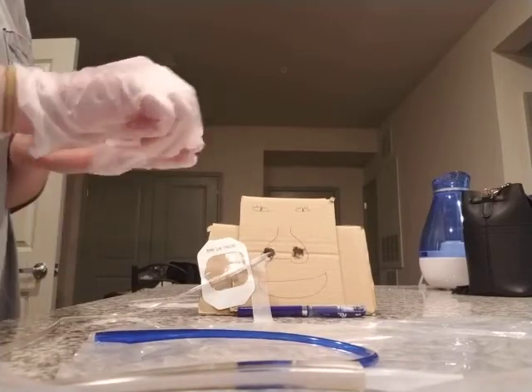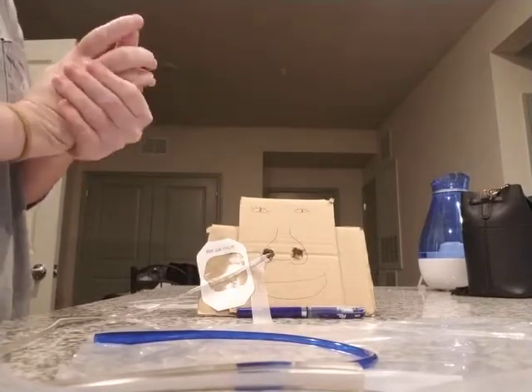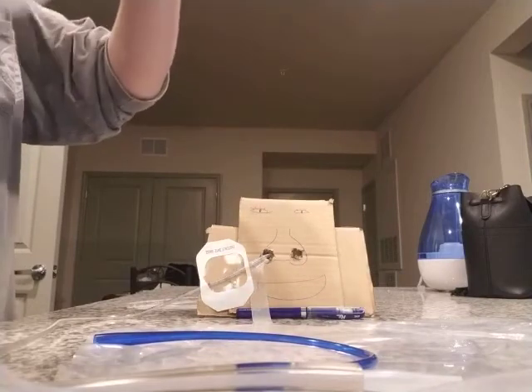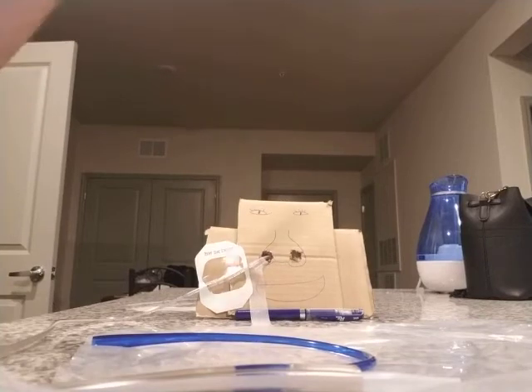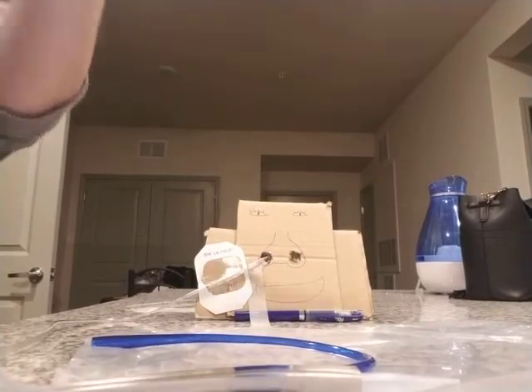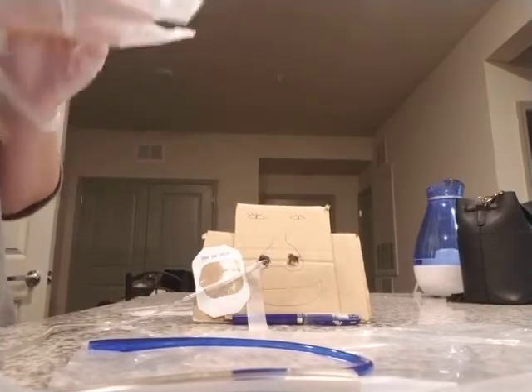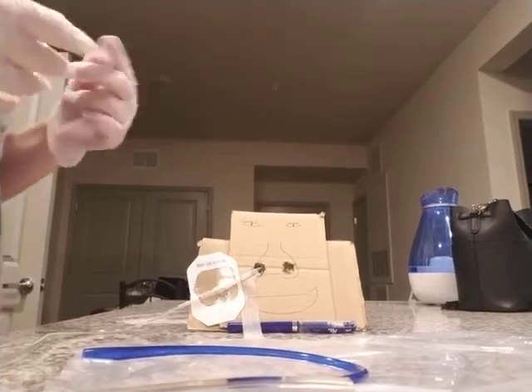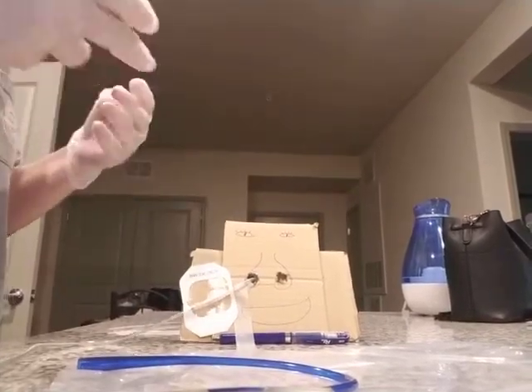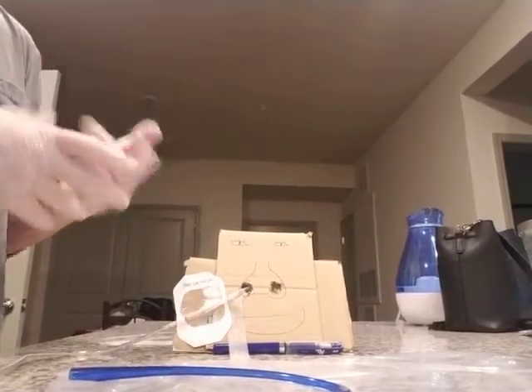And now I'm going to remove my gloves, perform hand hygiene, and put on clean gloves. If we had a suction device, I would now keep the head of the bed elevated to at least 30 degrees unless otherwise indicated, and I would attach the NG tube to the suction source and establish suction at a low intermittent setting unless otherwise ordered.